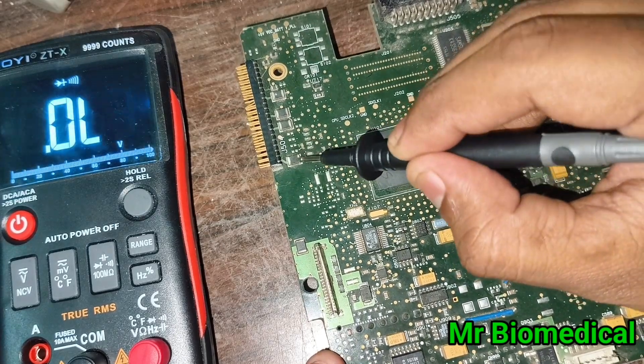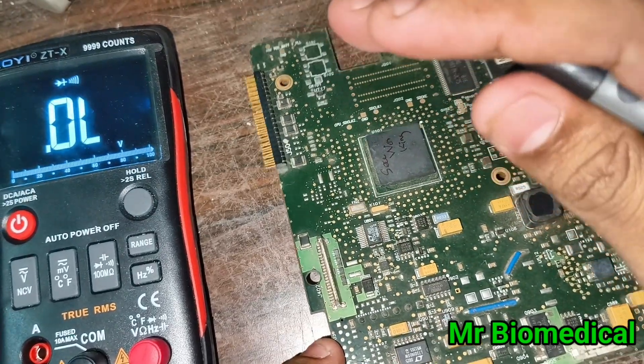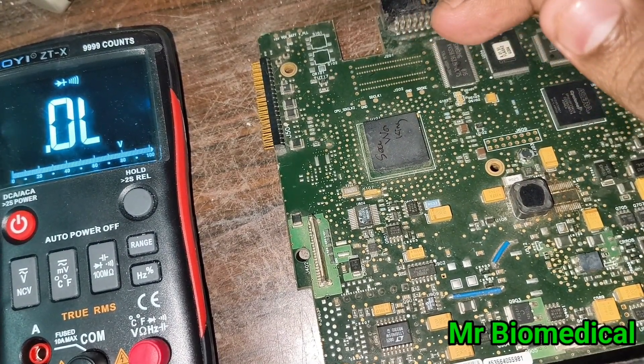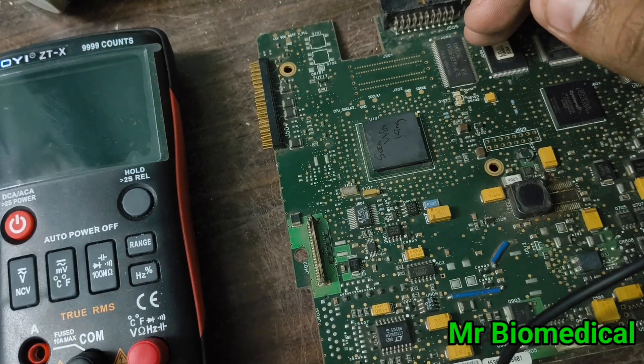These are the fuses — remember you have to check each and every fuse. It must be done because sometimes a fuse will be blown and you will not see it visually. That makes all the difference.